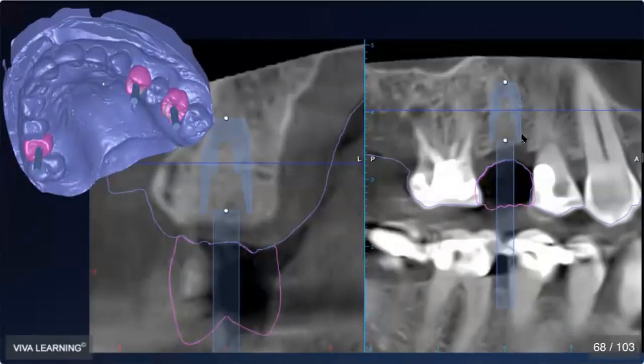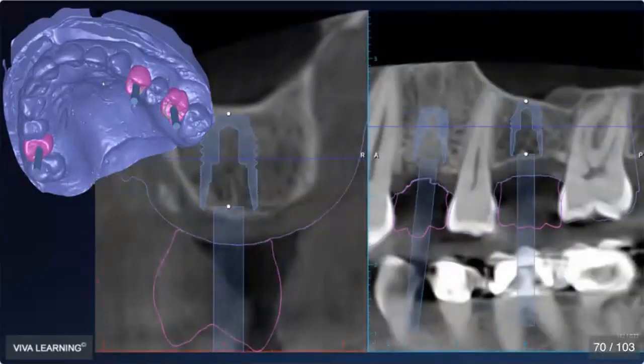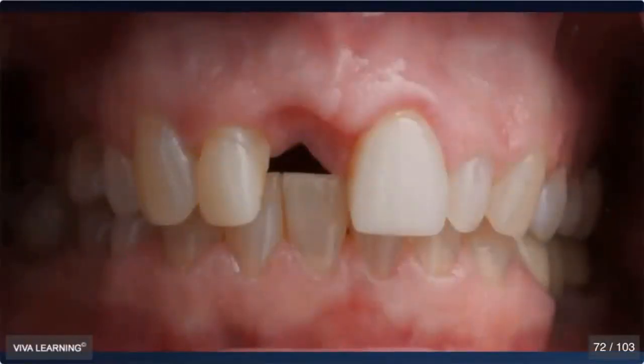And if you look at the two-dimensional cross-sectional view on the right, then we can look at the post-op periapical radiograph overlaid, and then we'll look at another example. Same thing. In this case, there's our post-op radiograph. So I find that on a day-to-day basis, kind of what you see is what you get with these cases, very predictable. And if you plan them appropriately, the surgical outcomes are extremely predictable. I've found that there's very little evidence, if any, that I'm getting error in these cases. So let's look at a case.